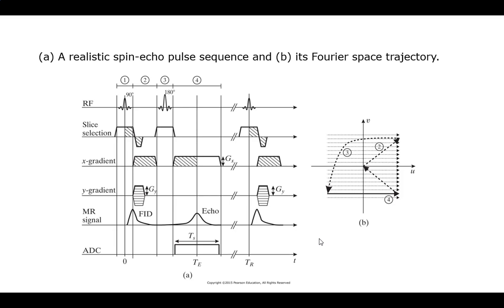Slightly more advanced scheme, the one we did 2 ago now. Because we just showed one where it just went down and went over. So now we're going up, instead of doing it 1, 2, flip, and done. This, again, is going to be that whole, in essence, 180 flip.